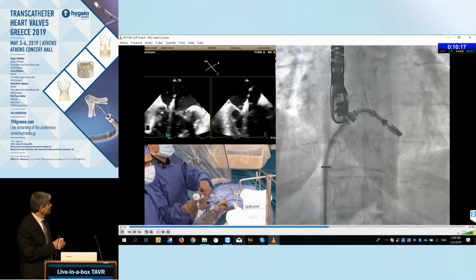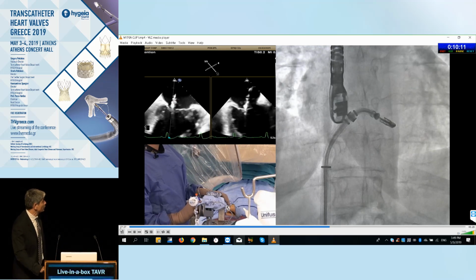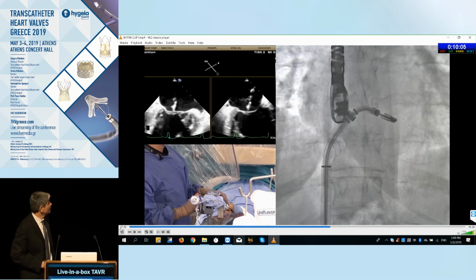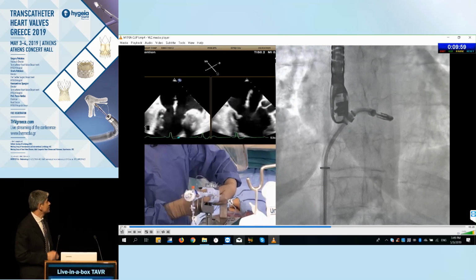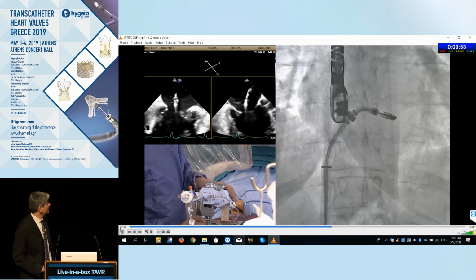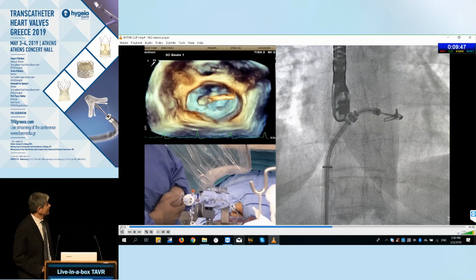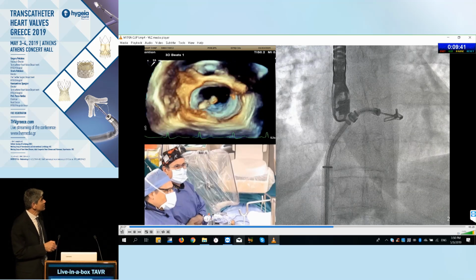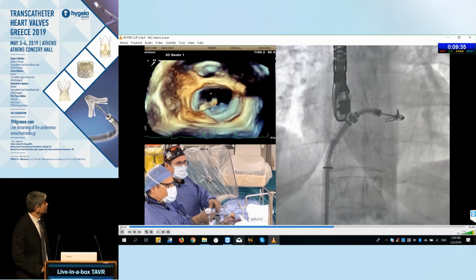Here we see the trajectory moving to the medial side, so we have to correct for that. We don't want to go into the papillary muscle and the chordae that sit below the medial commissure. So corrective measures are taken to have a trajectory right at the center of the valve, aiming towards the apex of the left ventricle. The trajectory will be reassessed again. Now we've opened the device and we look for perpendicularity. They obviously were very parallel to the coaptation zone, so we're going to be rotating the device counterclockwise to be perpendicular to the coaptation zone.